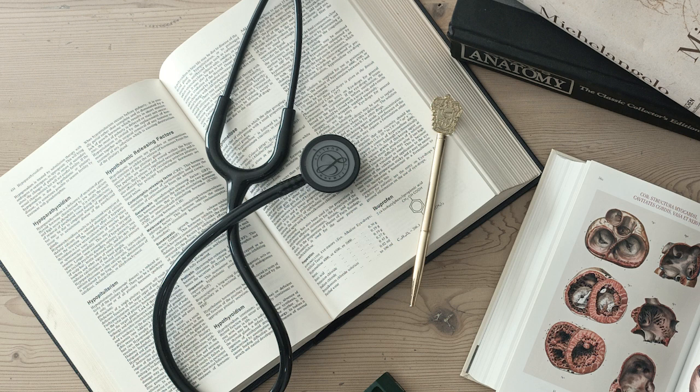For example, in atrial fibrillation or flutter with significant AV nodal block, the ventricular rate might actually be normal or even slow, despite the underlying atrial tachyarrhythmia raging away. Interesting point. So the key assessment points are, what is the rate? Is it fast or slow? What is the rhythm? Is it regular? If irregular, is it regularly irregular, like maybe bigeminy or Mobitz, or irregularly irregular, like AFib? This systematic approach guides your ECG interpretation, allowing you to narrow down the possibilities before you even lay eyes on the tracing.